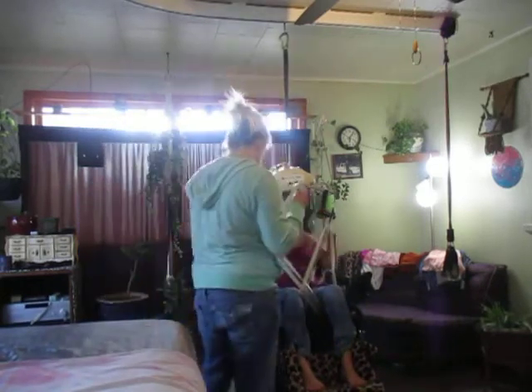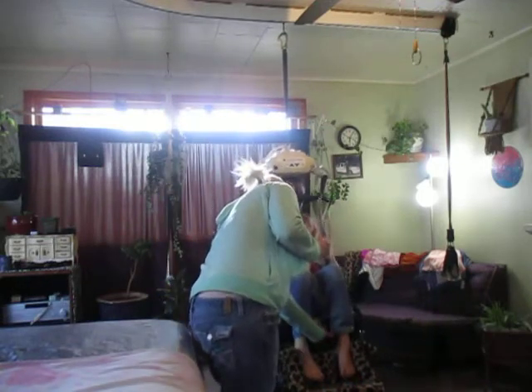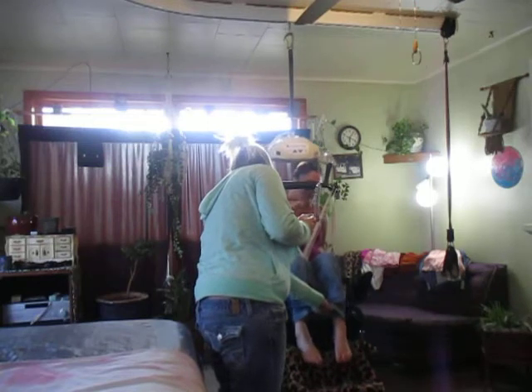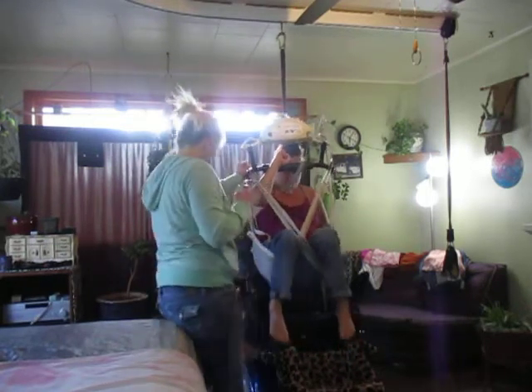And I'm in. I always got to watch the extra straps too, because they tend to get hooked on things. As I get lifted, you see how she's pulling my feet out? My feet will get snagged underneath my seat.